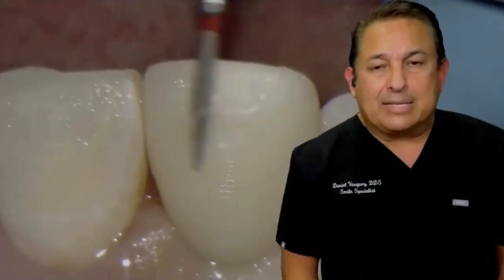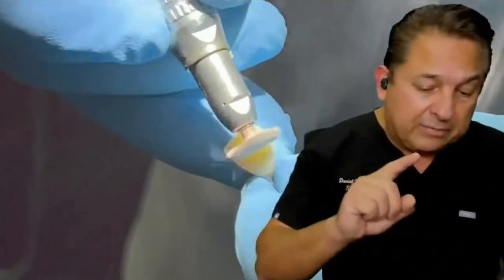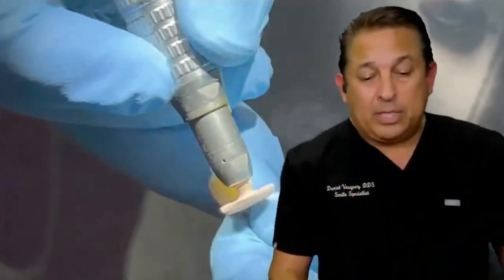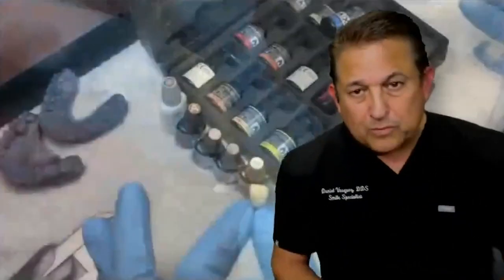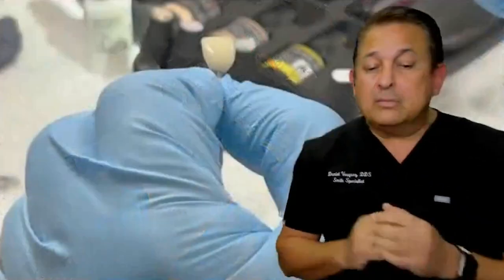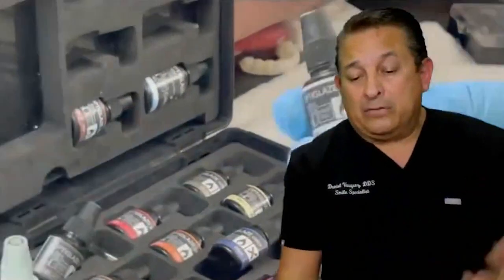This is plastic, but we have stains and glaze that we can use, so we can make it look good. So we have to give the shape, the form, we're going to texturize it, okay? And then we're going to start polishing. Once we finish with the polish, then we're going to be using the stains. Very important. You get the stains, you apply the stains. And the cool thing is all you have to do is get your light and cure it. That's it. No special appliance, no special equipment, just your cure light, put it in there, and that's plenty enough.